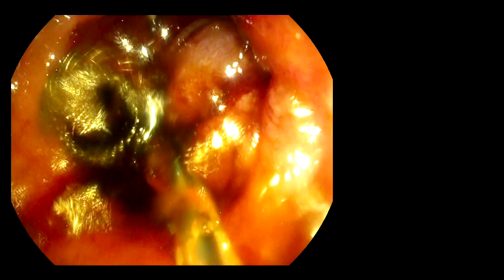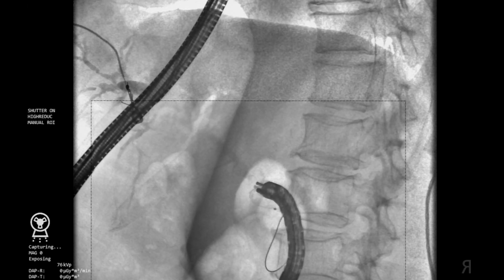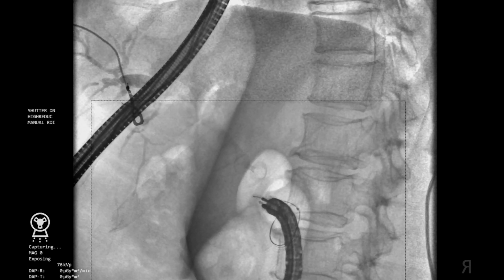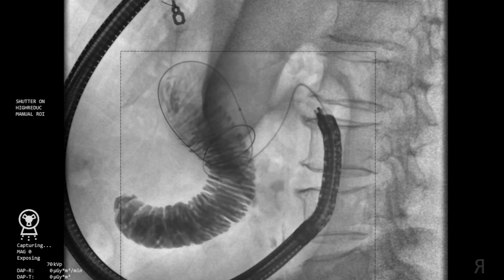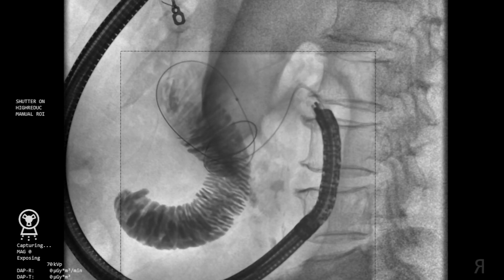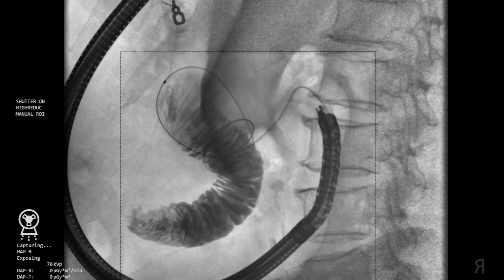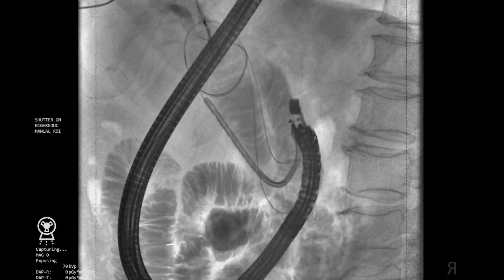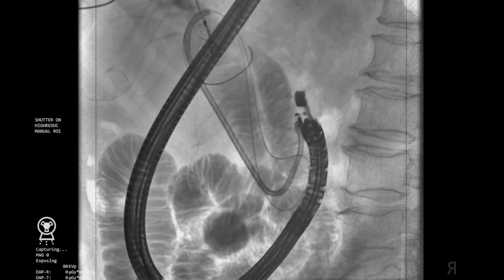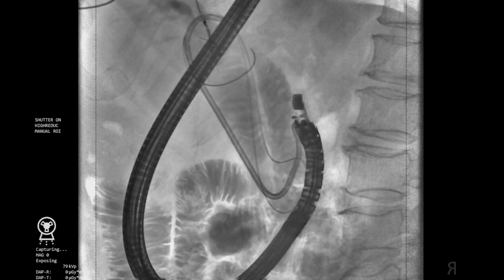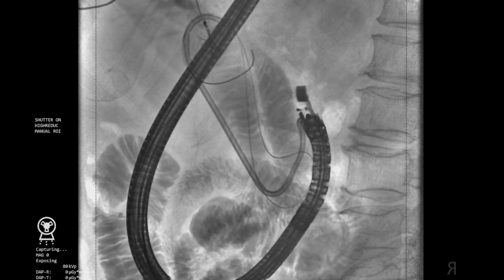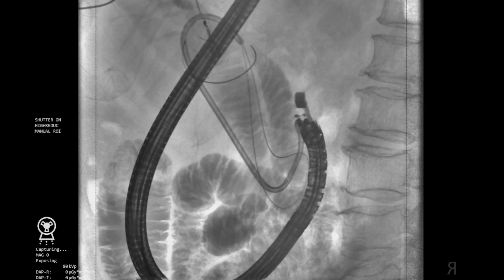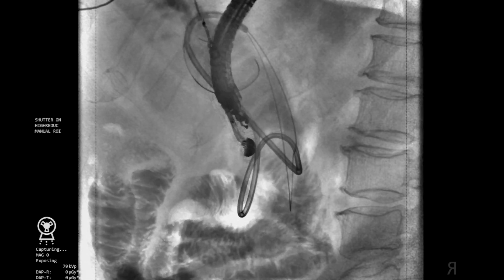A tandem ERCP catheter was first inserted through the duodenal stenosis, which then allowed a 0.025-inch guidewire to be passed into the duodenum. Contrast was injected through the catheter to confirm guidewire placement in the small intestine. The tandem catheter was then removed and a 10-French nasal jejunal tube was inserted over the guidewire in order to instill saline mixed with methylene blue and contrast into the jejunum.